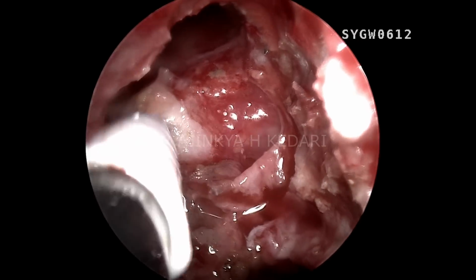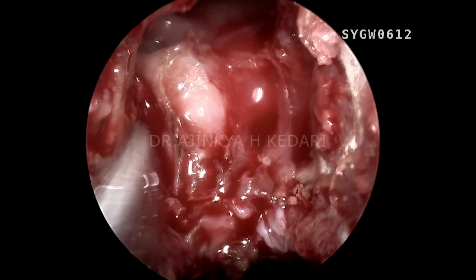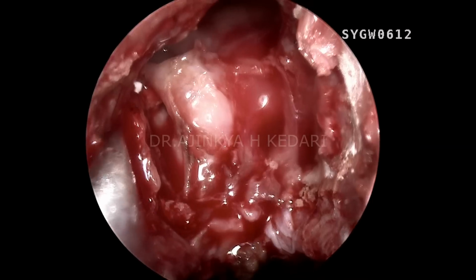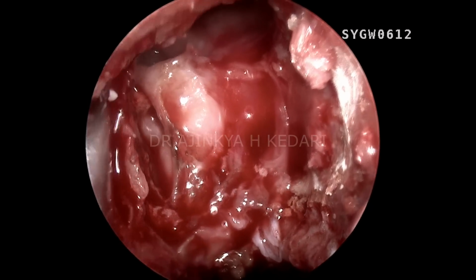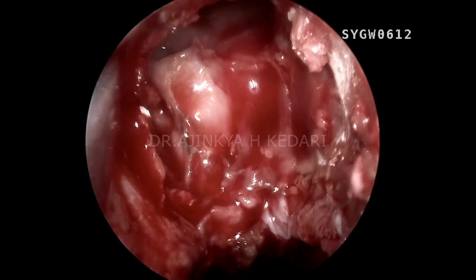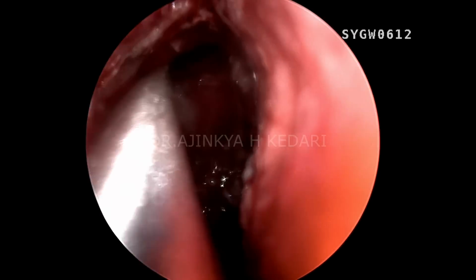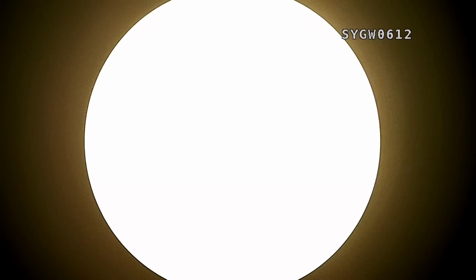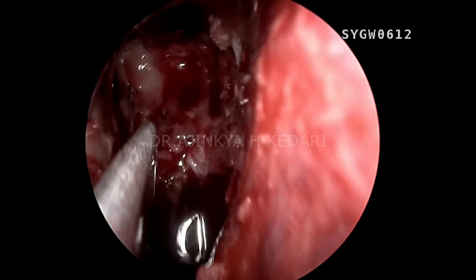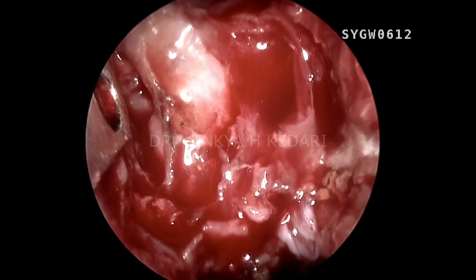For one more reason: when we put the free fascia graft and the Hadad flap, it requires a raw surface area and a flat surface area. Now what you can see right now, I'm trying to transpose the orbit. What I'm doing right now is I'm transposing the orbit and the skin above to get more visualization to the defect.